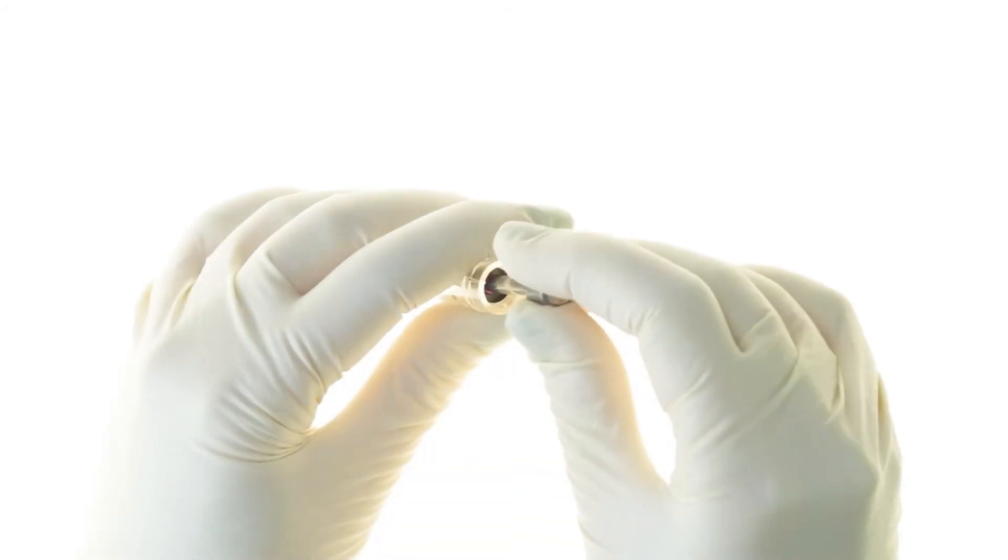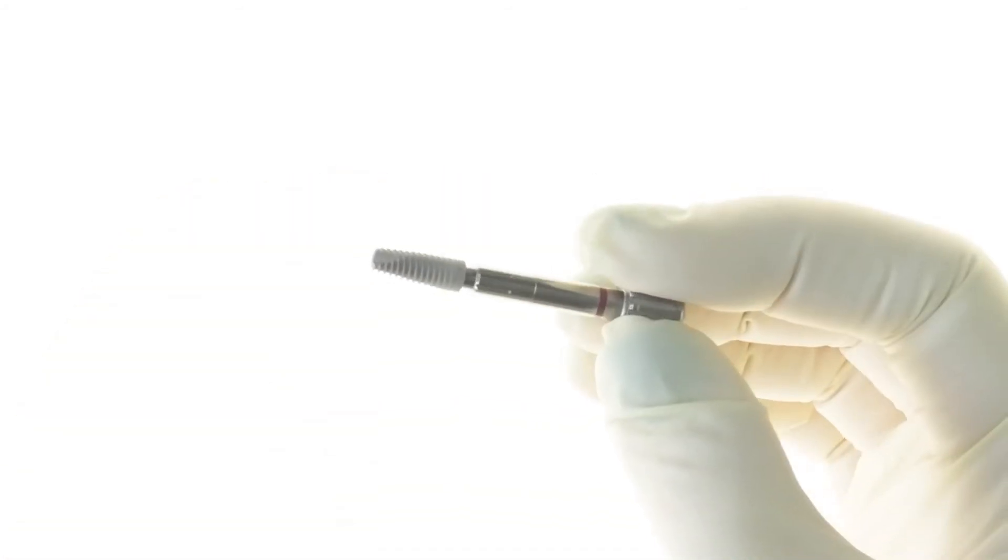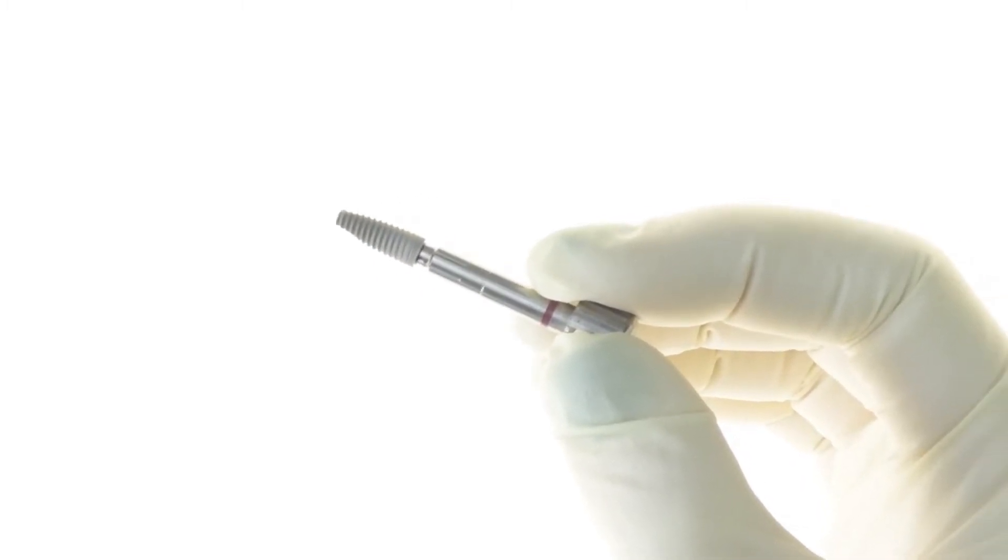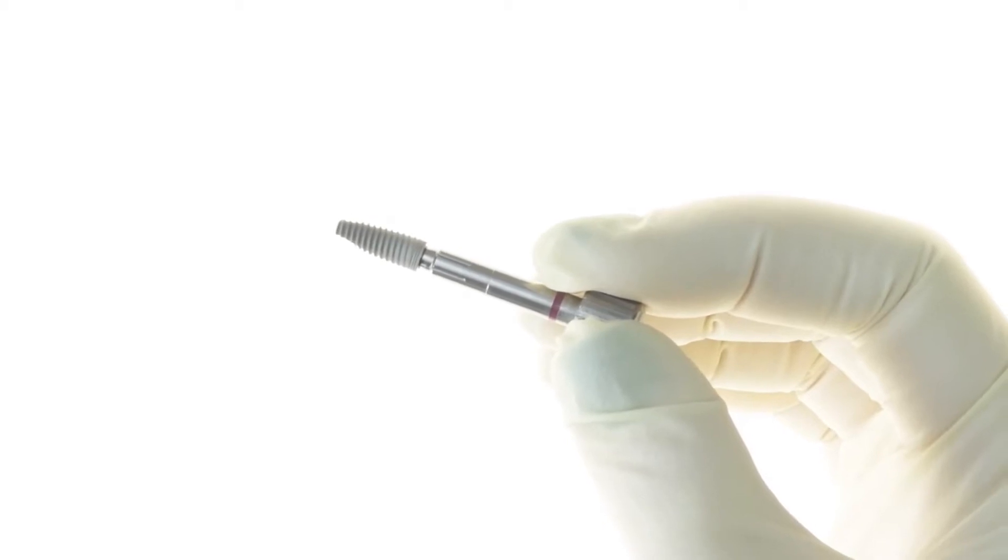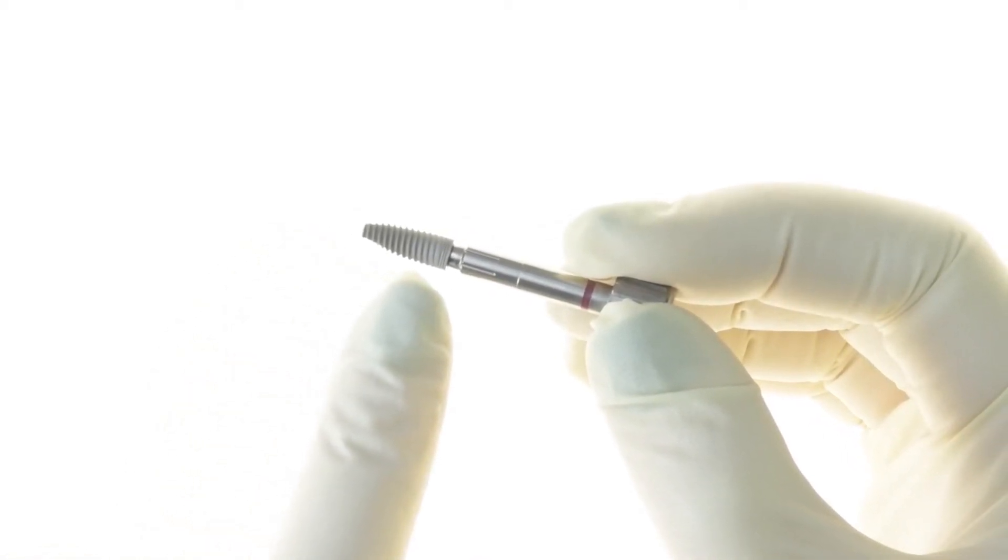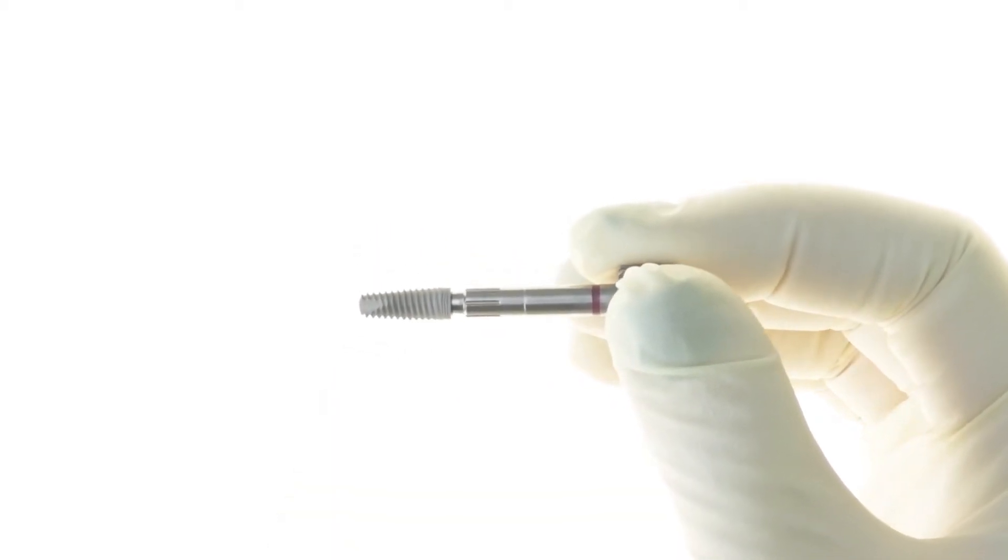The C1 is easily removed from the internal packaging using an insertion tool. The root-shaped design of the C1 provides horizontal compression, while the variable thread design combination of thin cutting threads near the apex and wider threads near the implant neck, together with the self-tapping abilities of the implant, enable high initial stability.